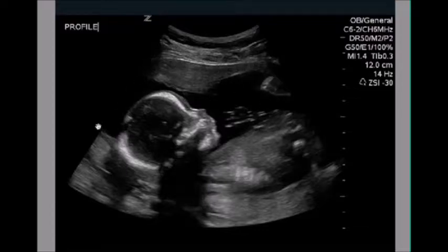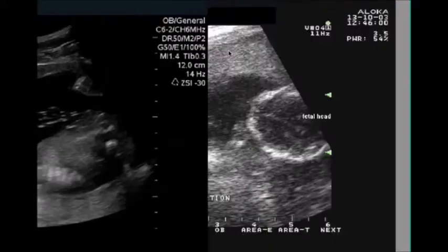Now this is the womb, mother's womb. This is the placenta, right over here. If you remember, this is closer to the skin. The skin is right over here. Just imagine the probe here with a dot. The skin is right here. So this placenta is to the front of the mother. So this is called an anterior placenta. To the front of the mother, closer to the skin.